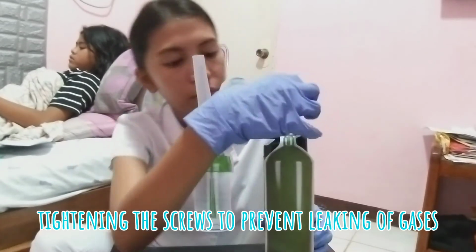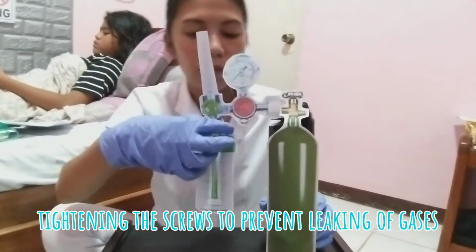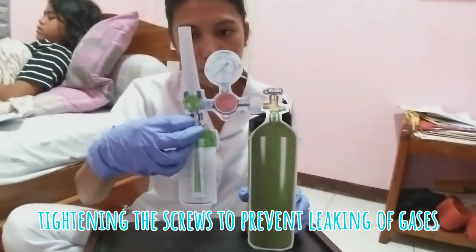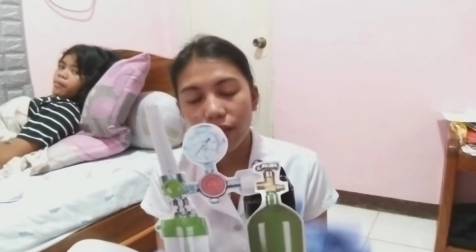Next, we will turn on the oxygen at the prescribed rate and ensure proper functioning. Check that the oxygen is flowing freely through the tubing. Make sure that the tubing is patent at all times and the equipment is working properly. This is to ensure that the right service is being administered to the patient and to prevent medical error.